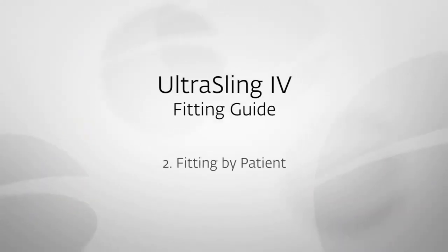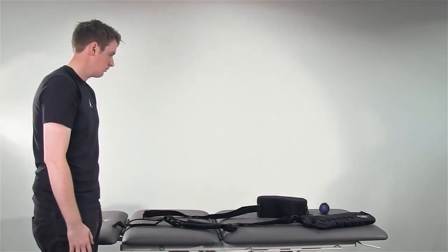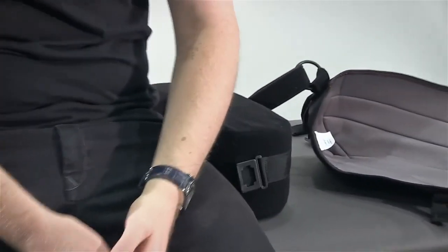We will now show you the simplest way for the patient to fit the brace themselves. We recommend that this is done whilst the patient is seated on the edge of a bed. Lay the sling with shoulder straps out on the bed behind you, with the sling positioned on the injured side.